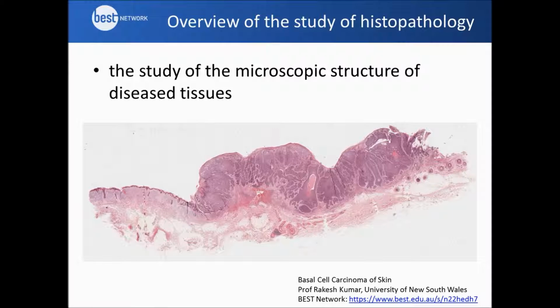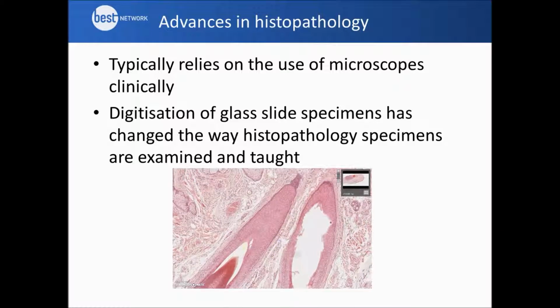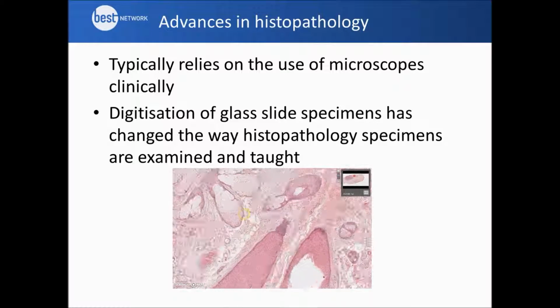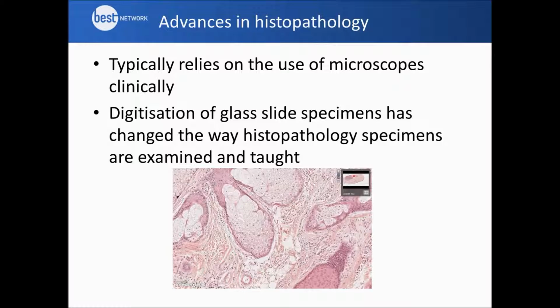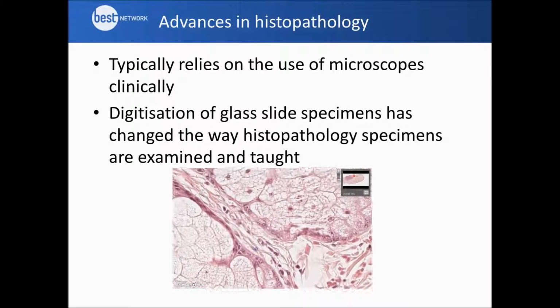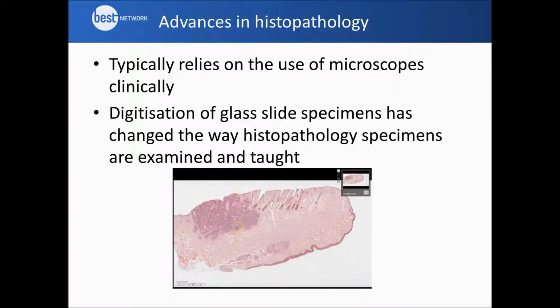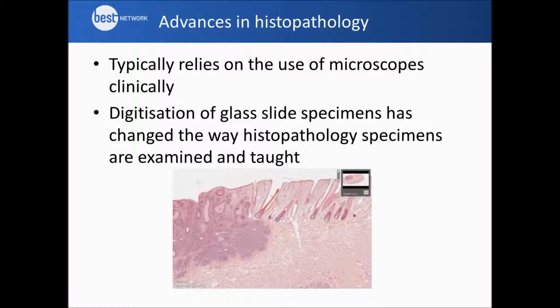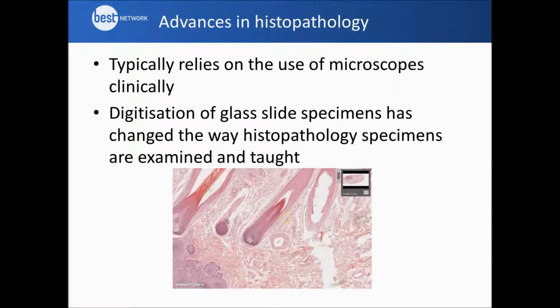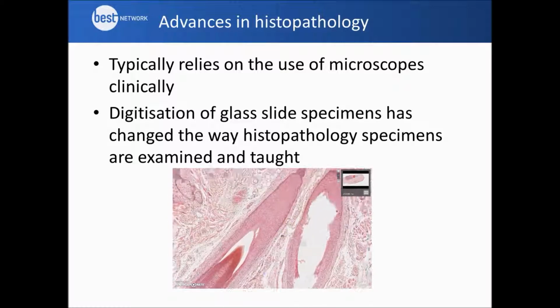This image here is an example of a digitized glass slide. Histopathology typically relies on the use of microscopes clinically, with the creation of glass slides with sections of tissue that are stained and examined under the microscope. A team at UNSW, led by Professor Rakesh Kumar, set up Australia's first virtual slide repository in 2003. And this changed the way it was taught, with less focus on the technique of microscopy and more on the tissue itself.